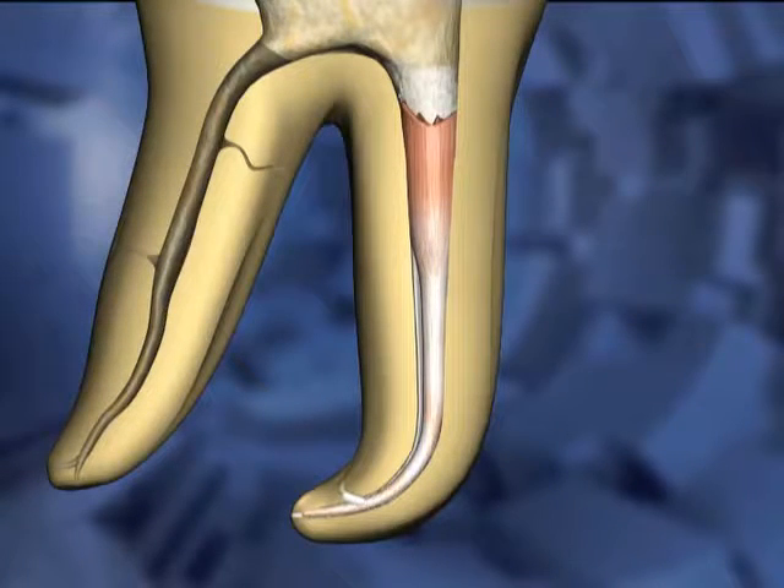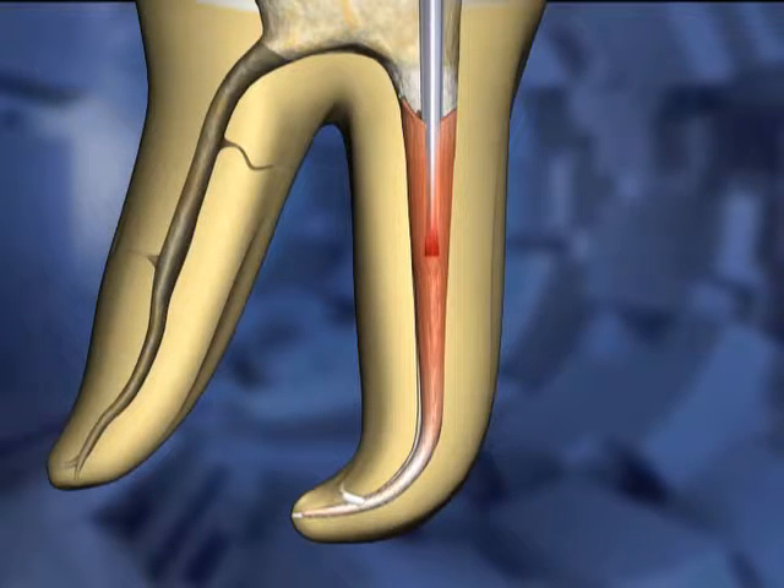In a hybrid downpack technique, the heat carrier is cycled on and off as it is inserted into the Gutta Percha mass. Initially, the hot carrier is inserted into the Gutta Percha mass several millimeters. Changes in the Gutta Percha color indicate where the material is being heated and softened.